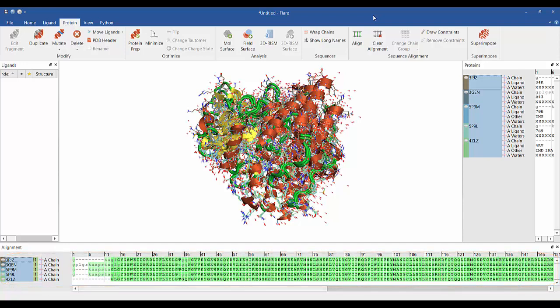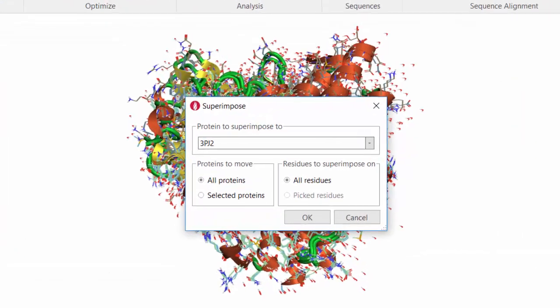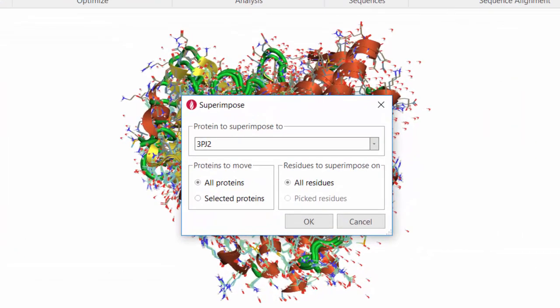Superposition can be done using the superimpose button, also under the protein tab. Choose the protein to superimpose to, if all proteins are to move, and if all residues or selected residues are superimposed.